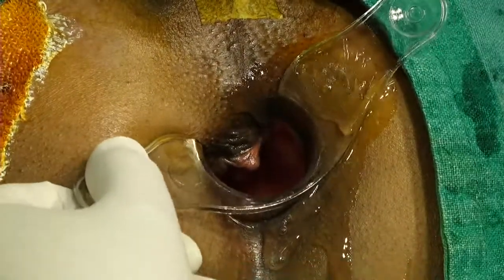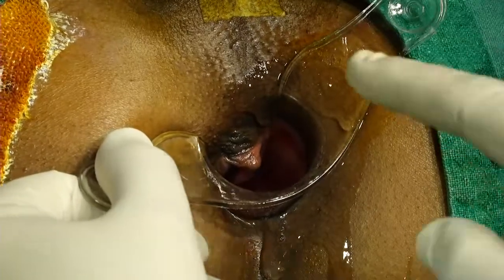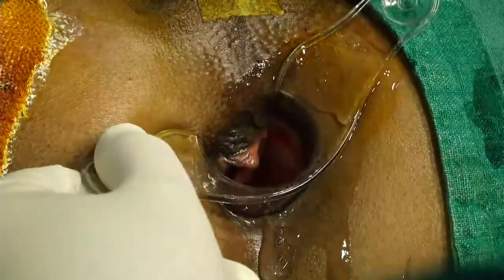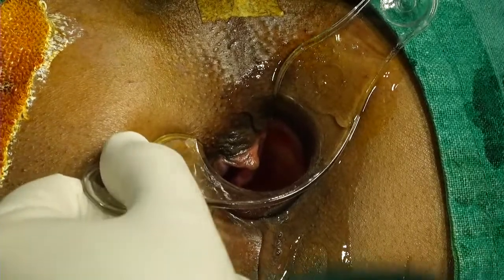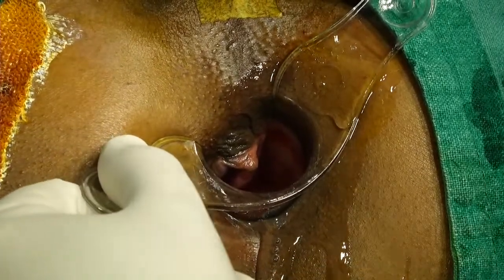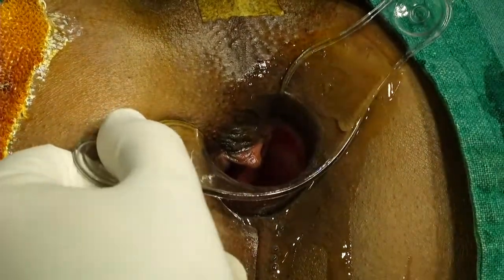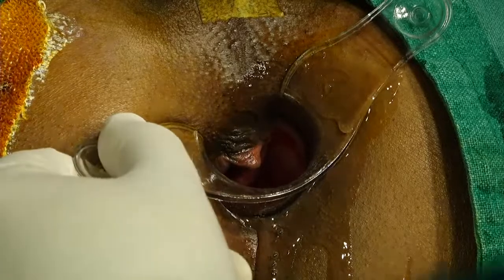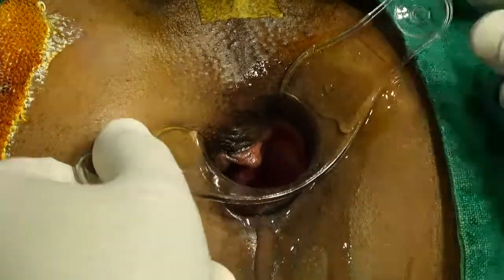But in my practice, when we do laser first, what happens sometimes, especially in low hemoglobin patients, immunocompromised patients, CLD patients, they develop a hematoma. And after hemorrhoidoplasty by laser with hematoma, HAL is not possible. So I am doing HAL first, then laser. Right.